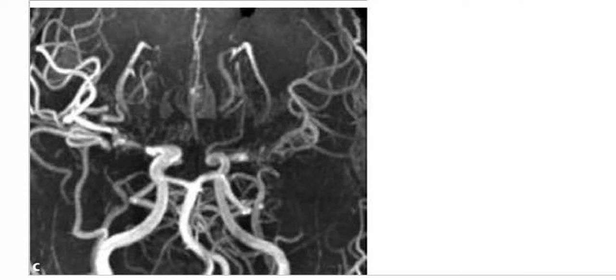This is the maximum intensity projection image from the MR angiogram, and it shows the terminal occlusion of the intracranial carotid arteries and proximal M1 segments with multiple small collateral vessels, giving a characteristic smudgy or puff of smoke appearance on the left. Also, there is filling of the distal MCA vasculature secondary to the cortical anastomosis. So considering the key finding of the carotid terminus occlusion with numerous basal collateral vessels, the diagnosis here is of Moyamoya disease. So this is the typical puff of smoke appearance of Moyamoya disease.